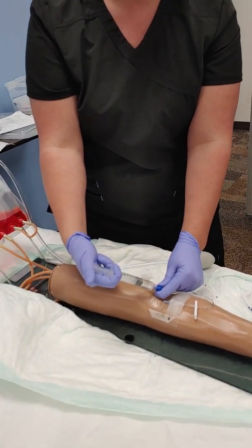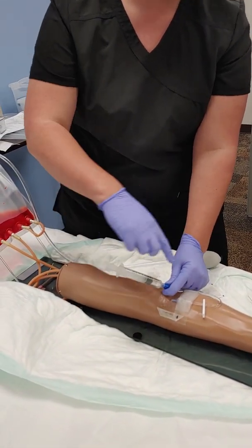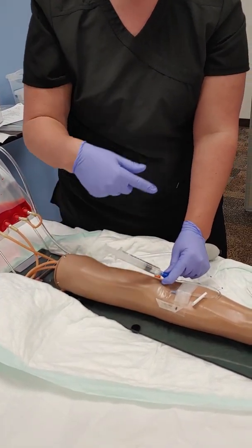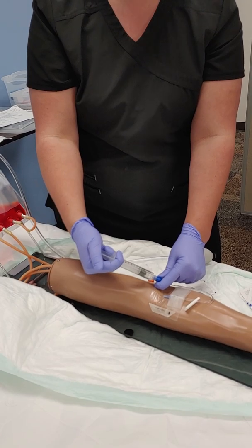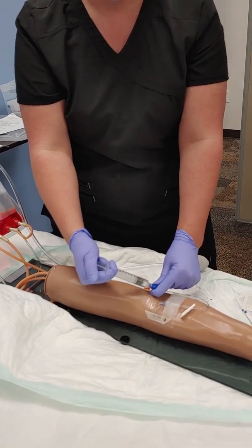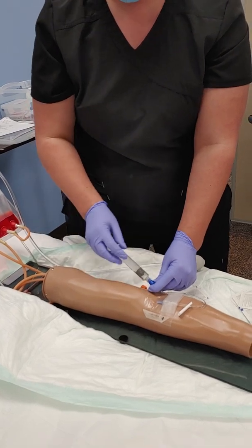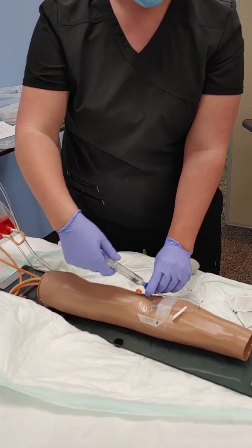You at least want to flush 3 to 5 milliliters because that gets it all the way through the IV and into the arm. You're watching your patient for any signs and symptoms of a reaction. Does it hurt? Is it flushing okay? Okay. Instill solution over 1 minute. Watch insertion site for swelling. Remove syringe when done.